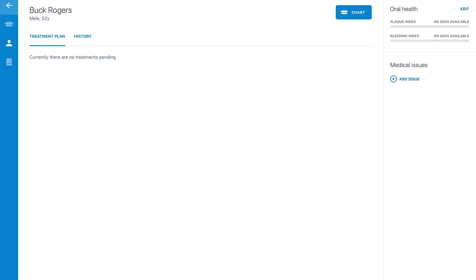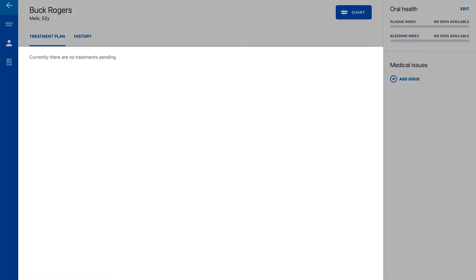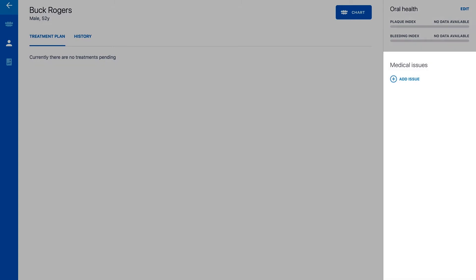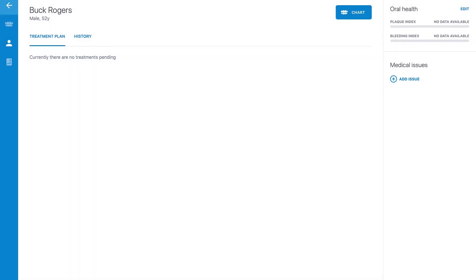The view is divided into three sections: the Treatment Plan section, the Oral Health section with information about the patient's current plaque and bleeding index, and the Medical Issues section, where you will see the most important medical health issue from that patient. The blue bar on the left side of the screen contains buttons for navigating to other screens.